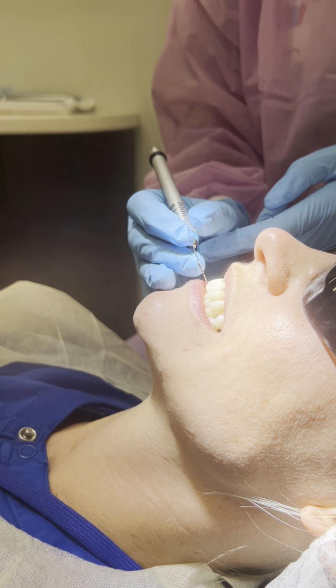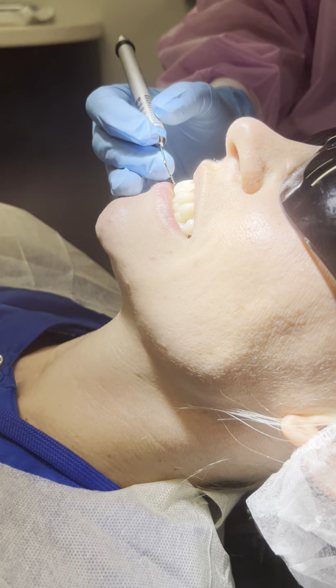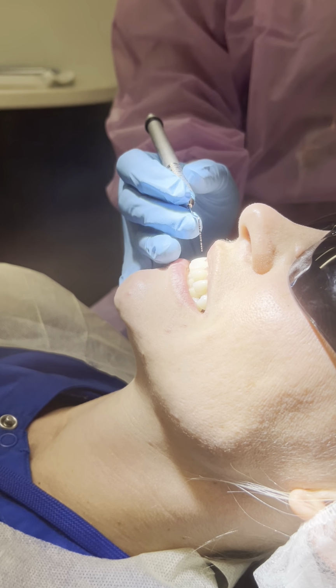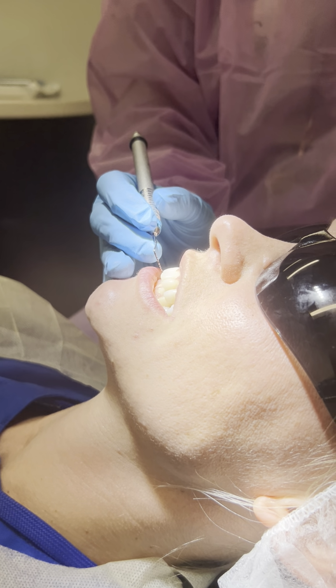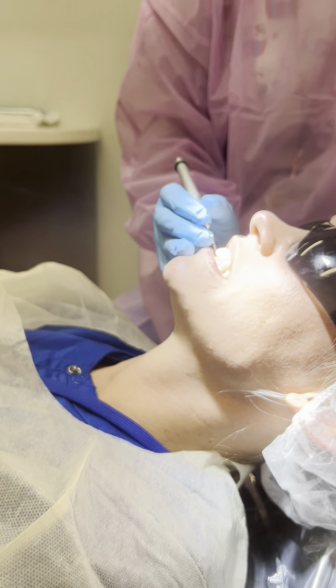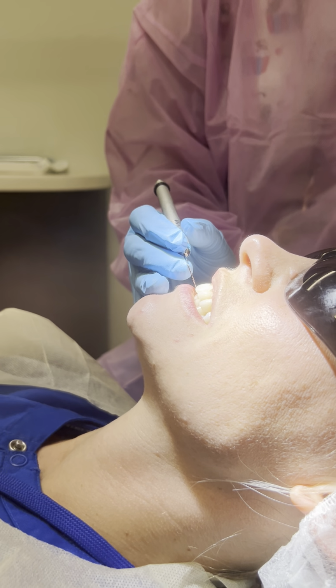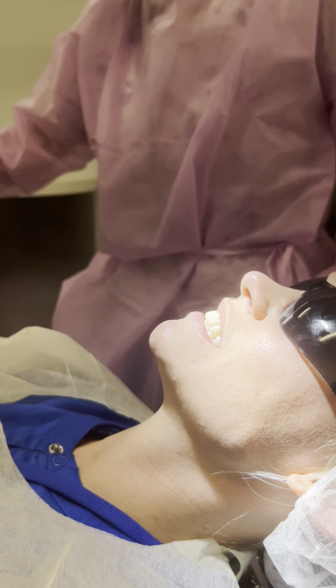I'm going to look from about 12 or 11 o'clock. What do you think is the reading here? 4? Well, 3. It's just hitting that black line, right here. Yeah, so that would be 4, because it's not on the other side, so it's not 5.